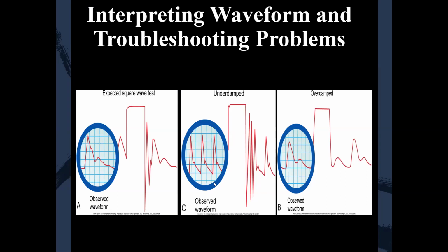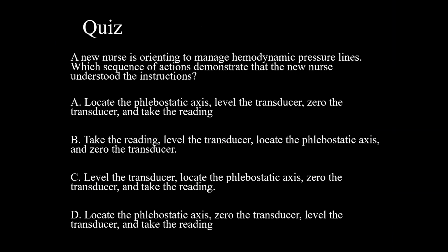Okay, a new nurse is orienting to manage hemodynamic pressure lines. Which sequence of actions demonstrates that the new nurse understood the instructions? So I want you to take a look at those answers. I'm going to take a sip of coffee while you're reading them, and you tell me what you think the answer is.